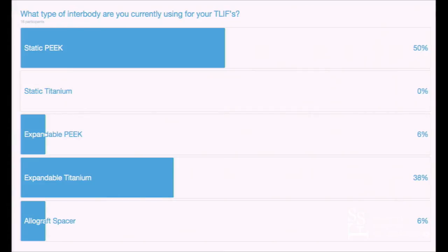especially in a TLIF, because I think TLIF is where you can get subsidence. It's not a lateral cage where you're spanning the ring, and the chances of subsidence are pretty low and it's stable. But with a TLIF cage, I think it's much more difficult to get a stable fusion. And if it's a non-union, then how do you confirm it?